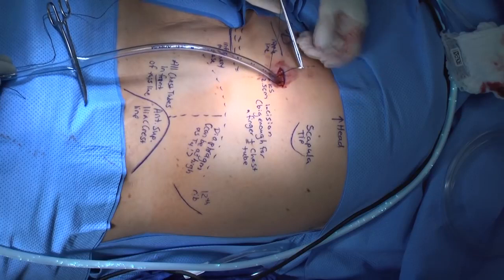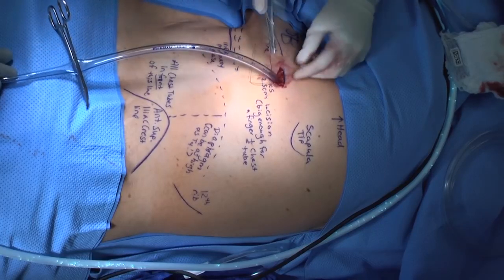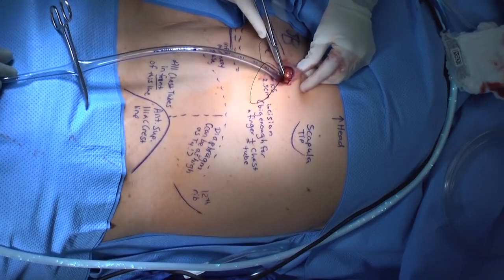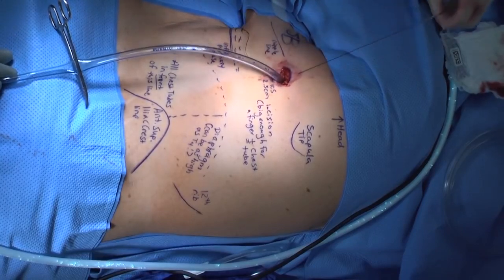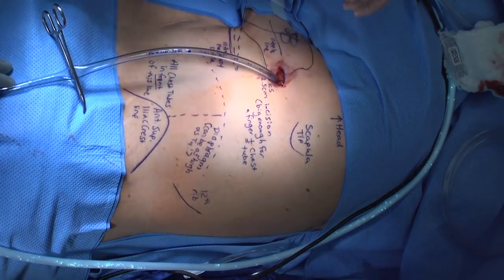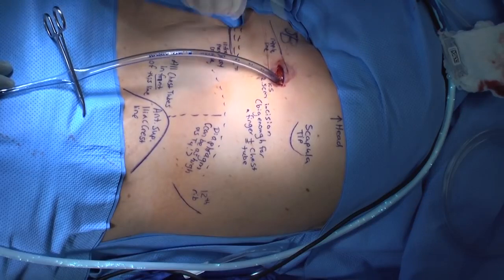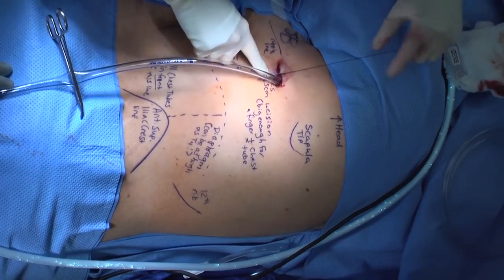Securing the tube is very important, just as important as placing the tube. We like to secure our tubes with a large silk suture. It is important to take large bites of the skin, as you can see us doing, so that the tube will not be pulled and the suture will not be pulled through the skin. Tie many knots.